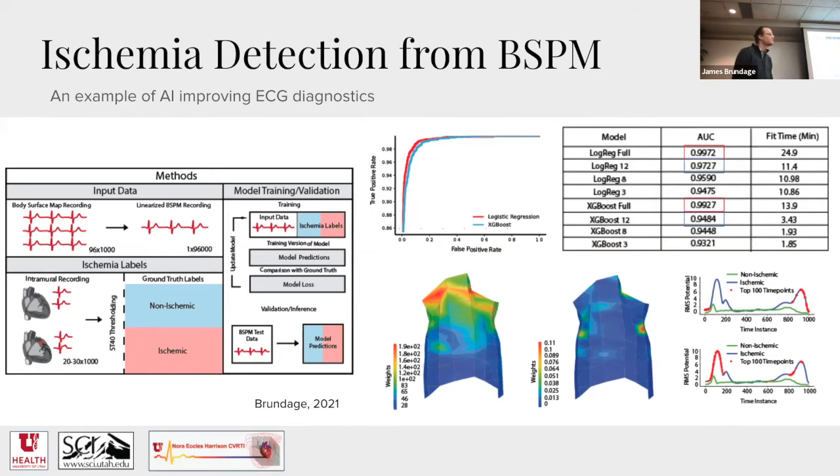So, your technique of selecting some subset of the nodes. How did you prioritize which ones? By the weight that the deep learning model applies? Yes. Actually, that's part of why we chose logistic regression and XGBoost, is they have really well built out ways to figure out the ones that are highly weighted versus not highly weighted.